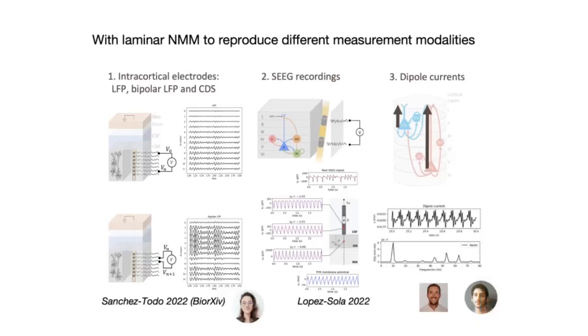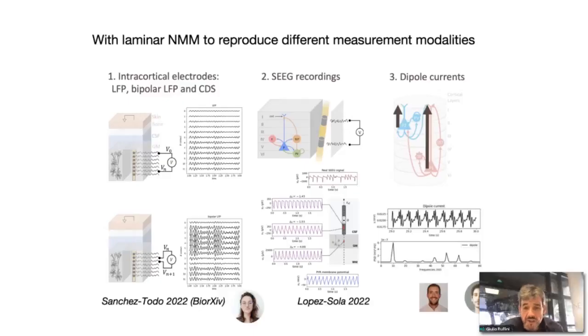And yeah, we have some papers now describing how this can be applied in the context of macaque data on the left, with macaque data generated by MIT, and where we can show that we can actually replicate pretty nicely the depth profiles of power with these kinds of models. On the right, you have a more recent paper where we apply this to SEEG recordings in epilepsy patients, and where we seek to reproduce the seizure dynamics.